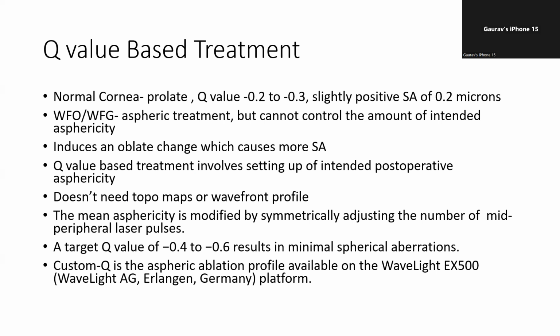Otherwise, topo-guided treatments had been available. Contura was born when the US FDA trial showed that there could be an advantage in treating virgin corneas with topo-guided treatments, not only diseased corneas or unhealthy corneas with aberrations, right? So I don't think topo-guided treatment is still FDA approved on non-virgin eyes. They still haven't approved it, but they did approve topo-guided treatment in part on the healthy normal corneas. So that is called Contura. Okay, sir.